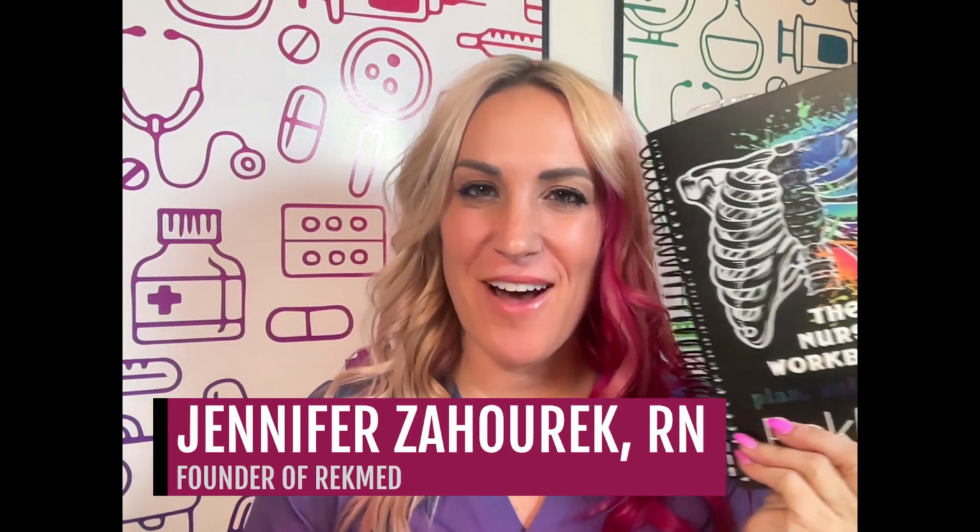Welcome to Cardiac Pacing. You can find this on pages 84 and 85 in your Nurse Workbook 2.0. You can go ahead and print the pages below this video so you can fill it out with me. A great thing to do before you start this lesson is make sure that you've already watched our Understanding the EKG, since these videos are building upon itself. There we go over our P waves, what every single wave means, so that way this is going to be efficient to your learning. So let's jump in.